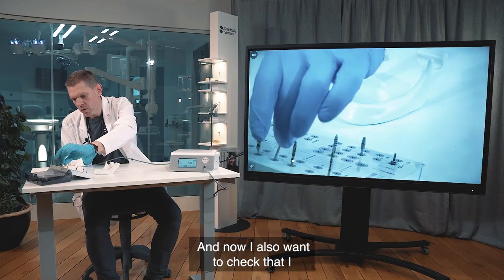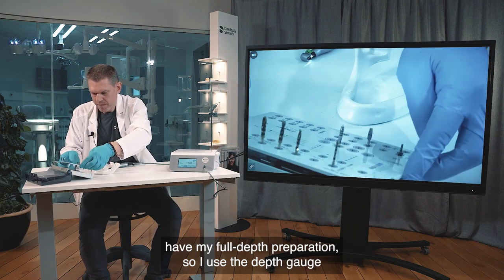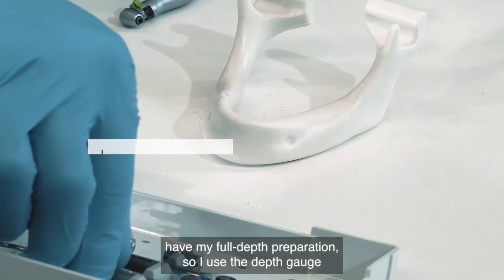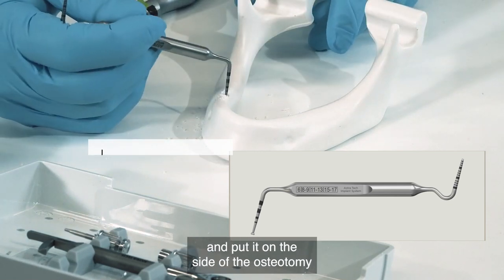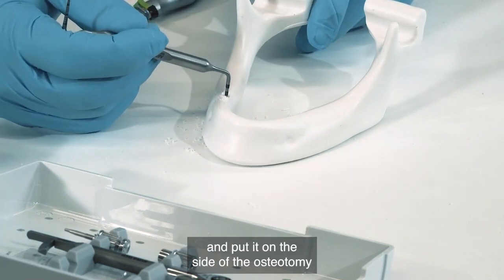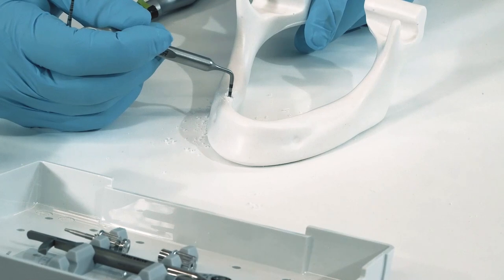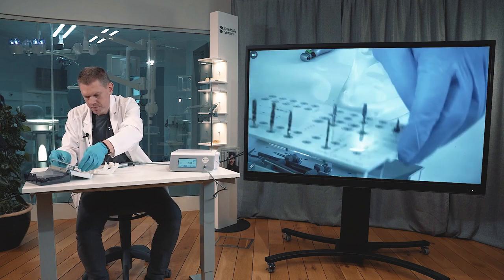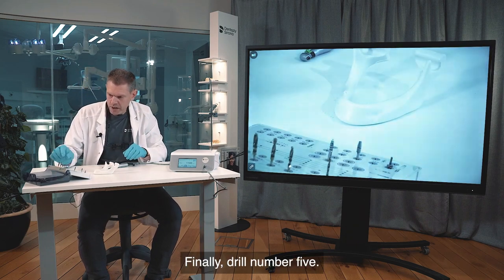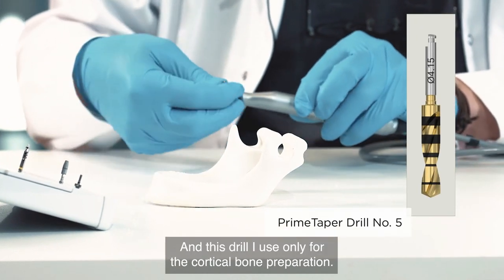I also want to verify the full depth preparation, so I use the depth gauge and place it on the side of the osteotomy to confirm I am at the full 11 millimeters depth.